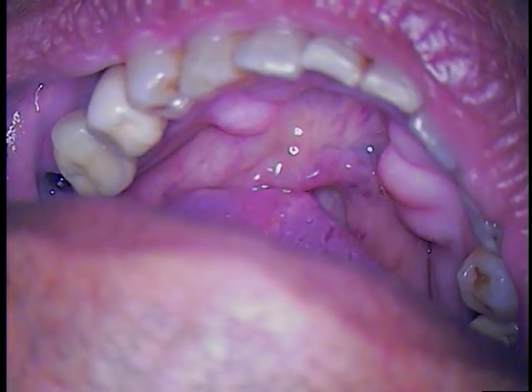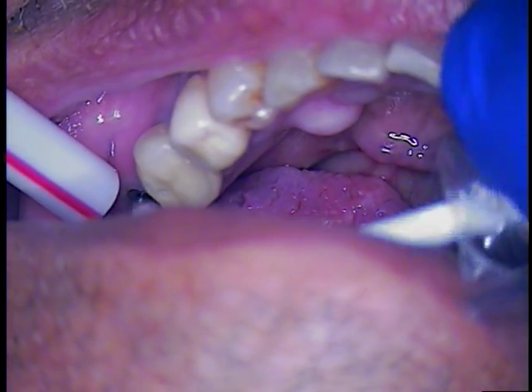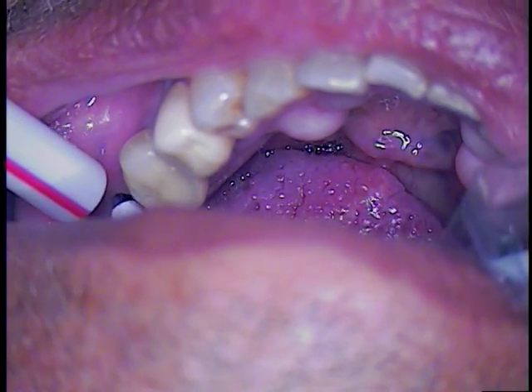Now we'll rinse that with water. Then we're going to take what is really a mild acid, and I'm only going to put a drop in there. This is what we use on dentures — it cleans any tartar from a denture. We've been very successful; we tried acetone products and solvents, but none of them work better than the tartar and stain medium, because it doesn't leave a residue.